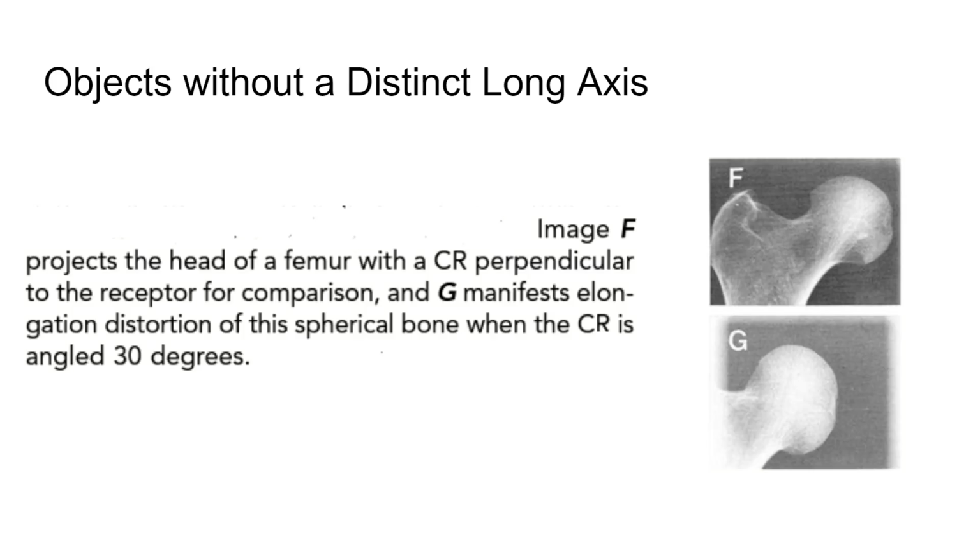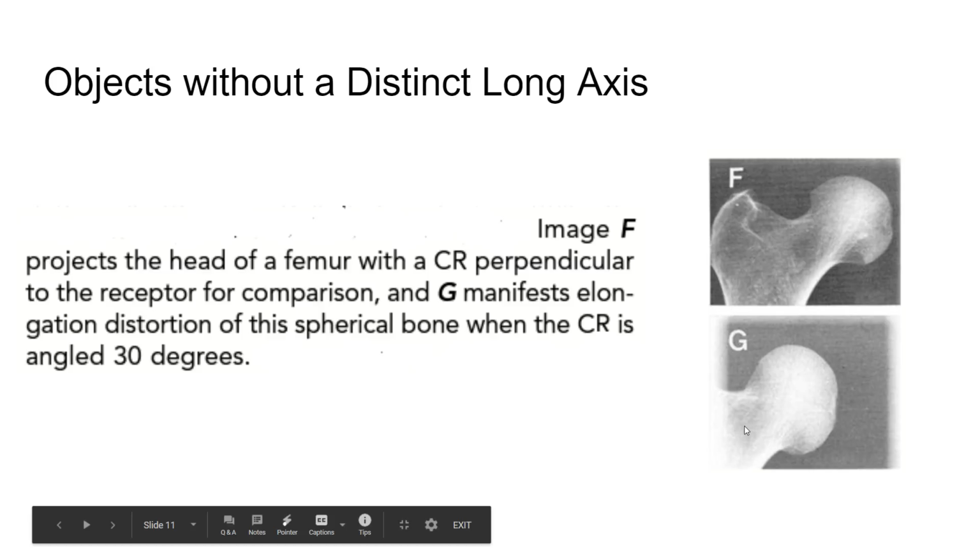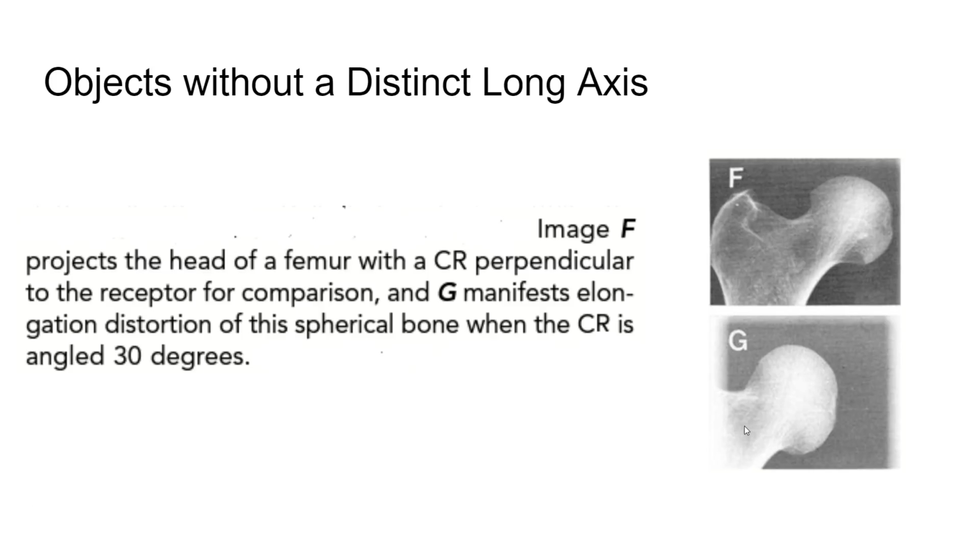Can that be caused without creating an angle on the tube? Like, could it be by, I don't know... Yeah, if the patient is obliqued in a certain way, that can cause the foreshortening, right? And that happens a lot too, because patients come into the emergency room and you don't really want to position them too much, especially if you have a fracture. Usually, I don't know if there's a technical name for it, but you kind of shoot as is. Sometimes when they first come in, has anyone seen this? I've seen it. You don't even want to internally rotate. You just want to get one image to see, is there a fracture?